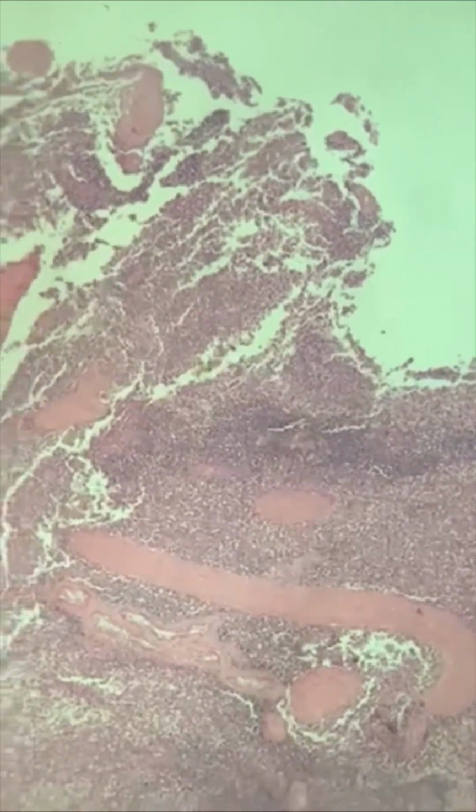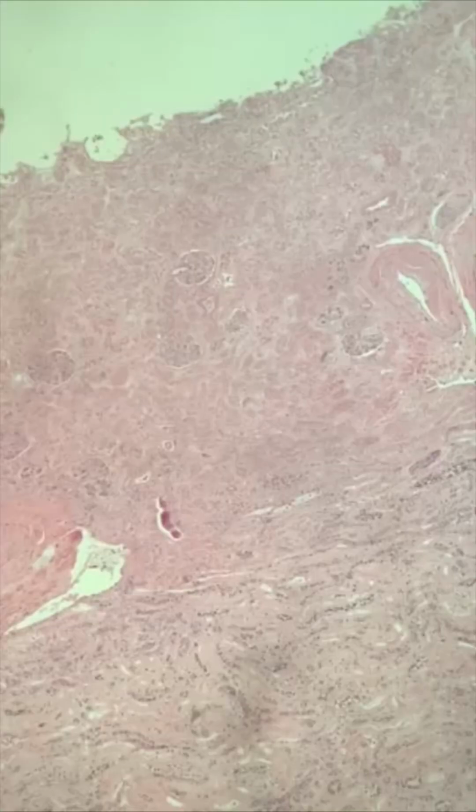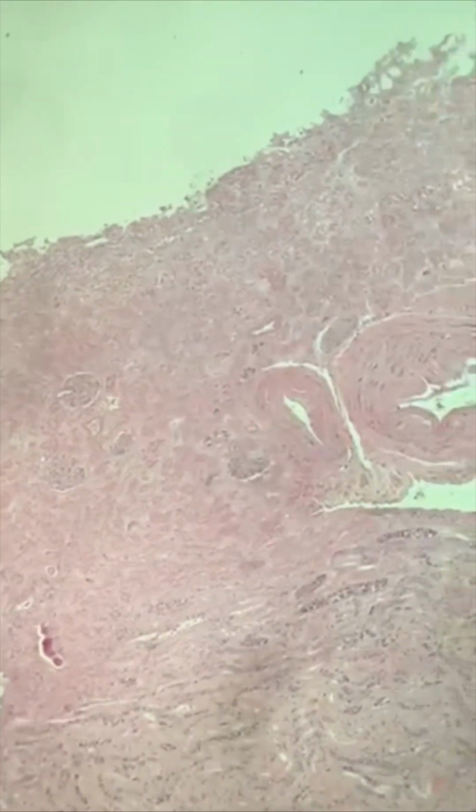Here is a section of spleen, and it too looks okay. A little edema going on with the spleen, but you still see the usual red and white pulp. We go to the next slide. Here are sections of kidney. Let's just go down to show you.